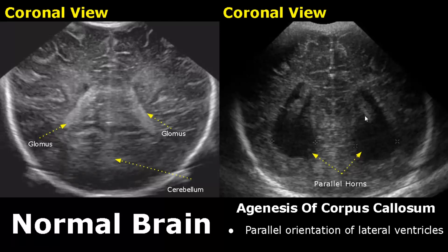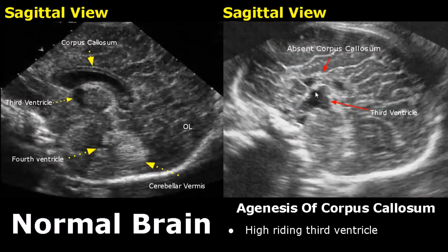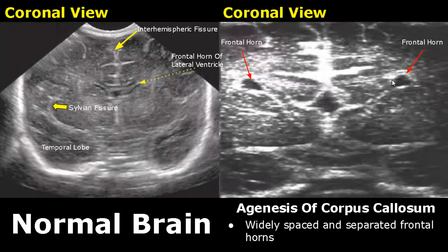In agenesis of corpus callosum, we will see parallel orientation of the lateral ventricles — the ventricles are in a straight line and parallel to each other. They are also enlarged. In this sagittal view we can see that the corpus callosum is absent. A high-riding third ventricle is also present, higher than its usual location. Another feature is the widely spaced and separated frontal horns.